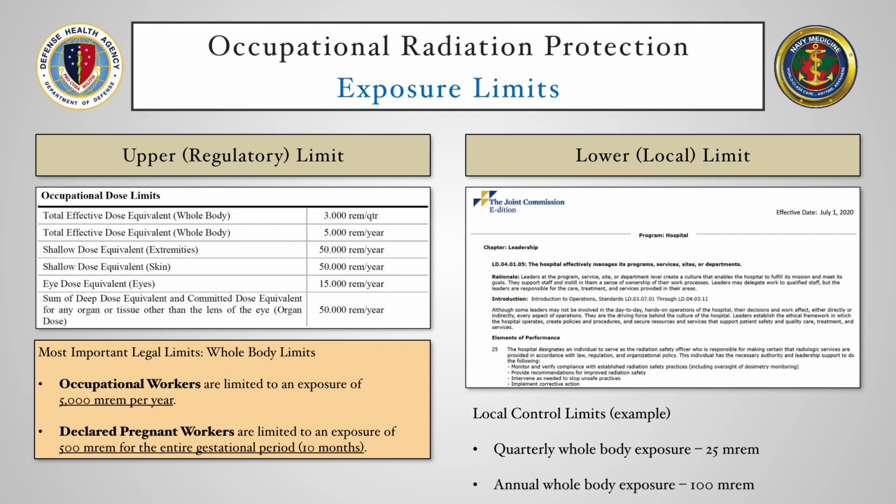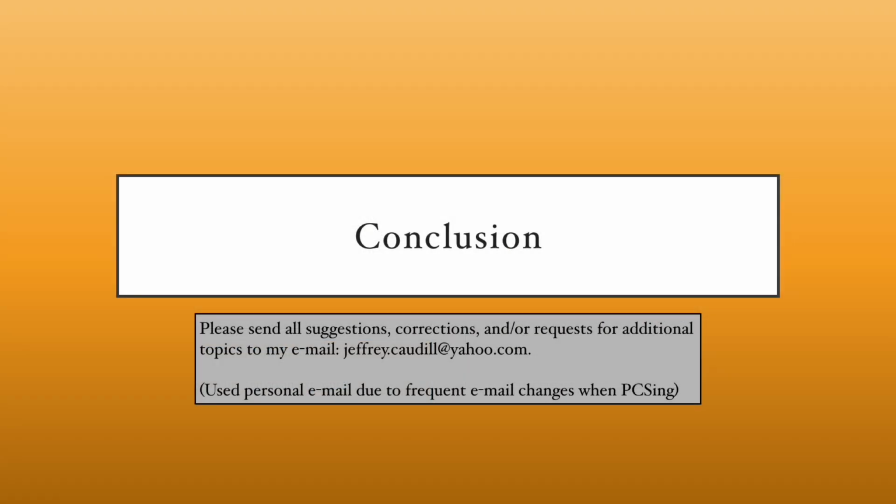If any quarterly result comes back greater than 25 millirem, I am immediately notified as the RSO, and a review with the technologist or radiologist is conducted. This is not punitive in nature, but rather a trigger to conduct a review of safe ALARA practices. This concludes the content of today's training.